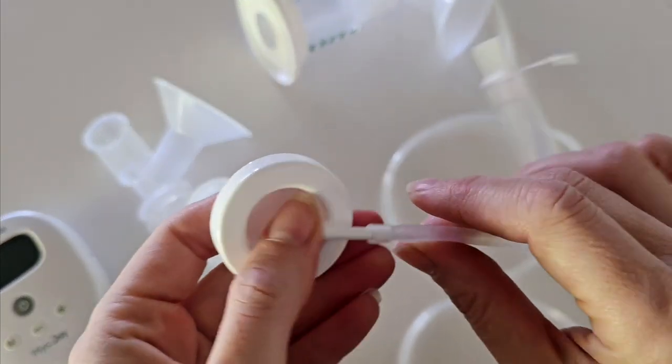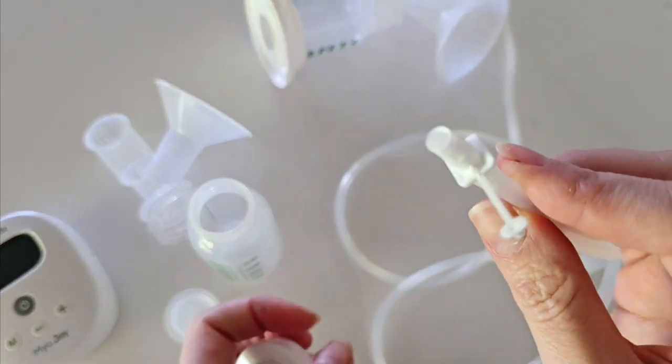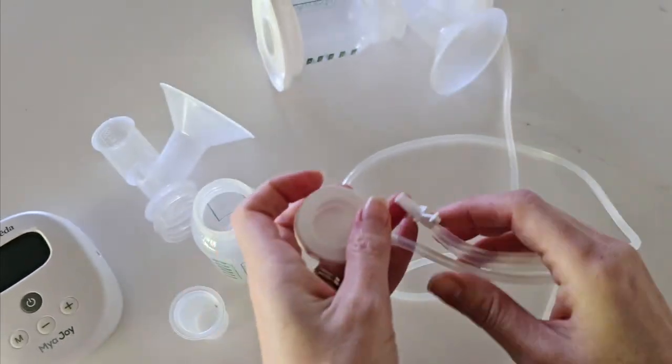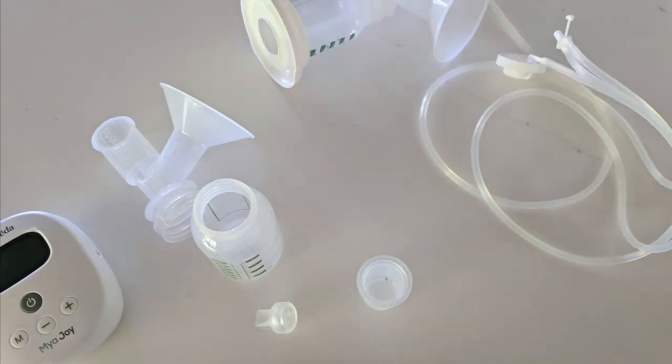We also have your diaphragm, your adapter cap which attaches to your tubing, and your tubing adapter. I'll go through these in more detail as we go through the video, but let's look at how to put this all back together.